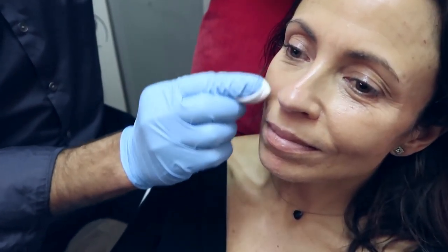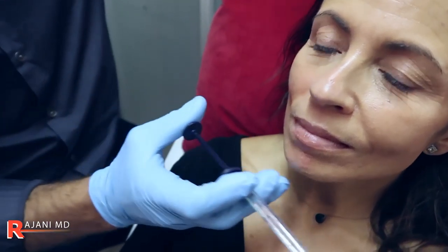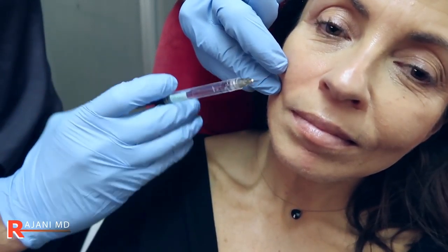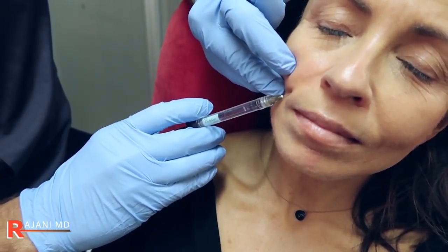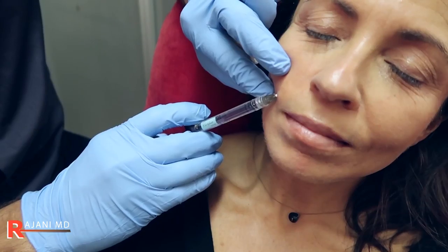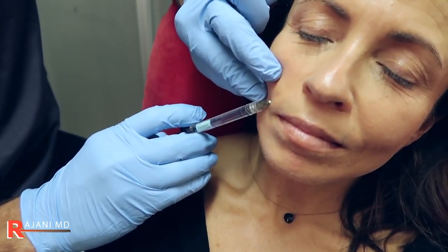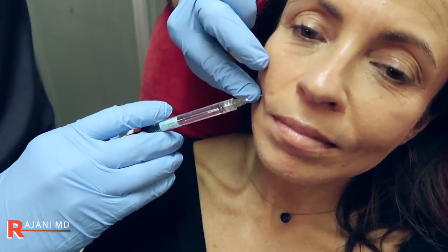I'm going to start with the droplet technique here. There are two ways to do it — we can do linear threading. I usually start at the bottom of the fold. I'll do the linear threading technique. We have Restylane Define here. Coming in — the bevel is not so important. I do an antegrade injection, creating a space. This is a 27-gauge needle. It flows very smoothly. And then injecting again. There's a little irregularity here but that's going to smooth out nicely.